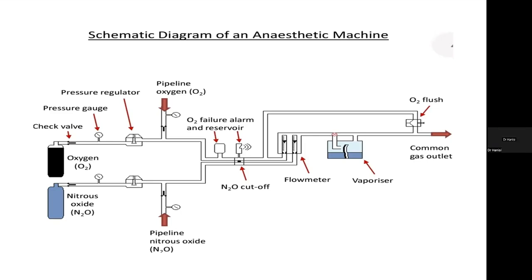Doc, is it not the larger cylinders which are connected, in series or in parallel, which are usually situated outside? It's for smaller hospitals. Yes, it's basically those bigger black cylinders. And if you notice, you'll find that maybe 3 or 4 are connected together.